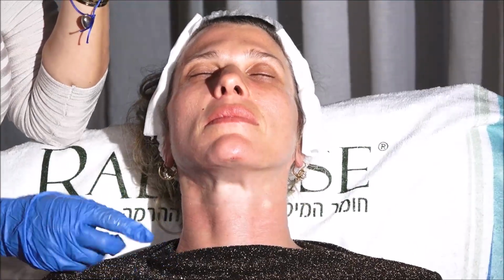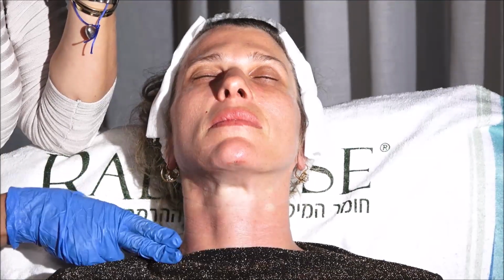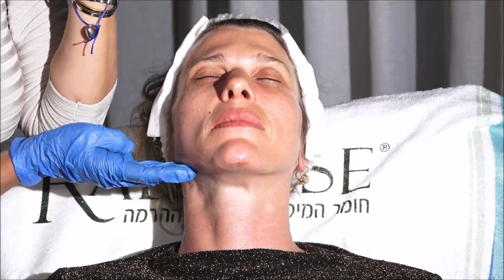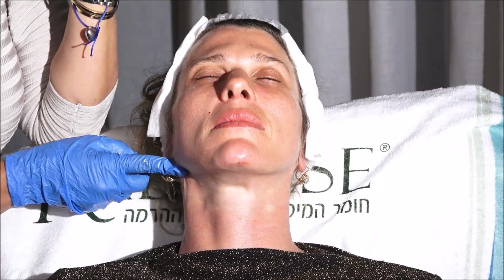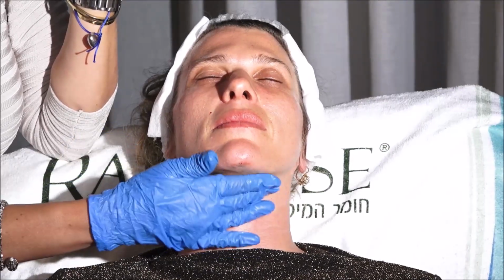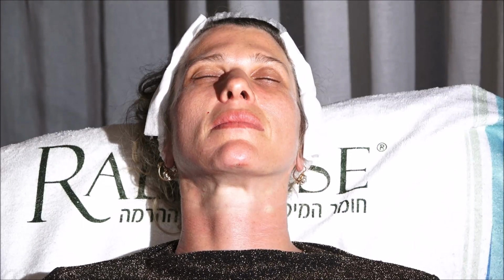Look how interesting. It looks like this neck is longer than this one, right? This distance is longer than this one because you're bringing everything more up, and you're bringing this area more up. So it's just an illusion, but it looks like this neck is longer than this one, although her face is correctly put.